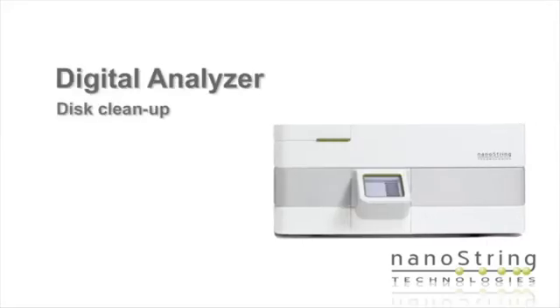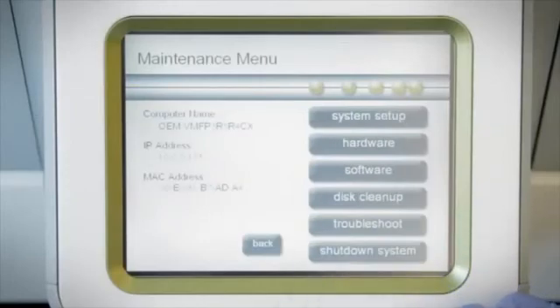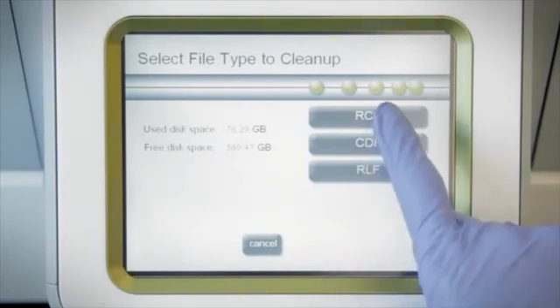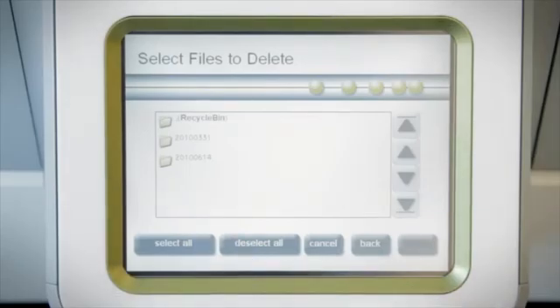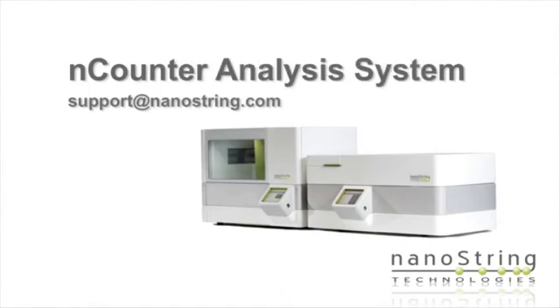Older or no longer needed files can be cleaned off of the hard disk by going to Maintenance, Disk Cleanup. You will then have a choice for removing either RCC, CDF, or RLF files. Choose the file type that you want to delete. You'll be taken to a folder that contains all the files of that particular type, and then simply touch and remove those files to clean off the disk. If you have other maintenance or technical support questions, please contact us at support@nanostring.com.